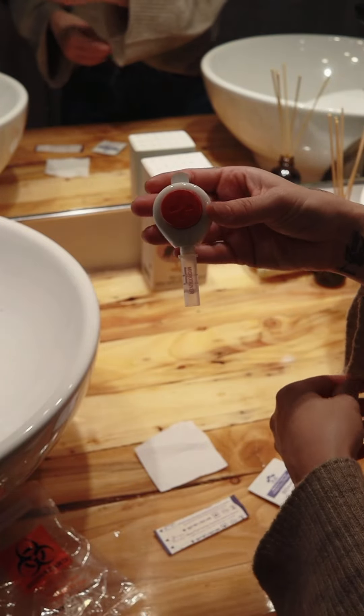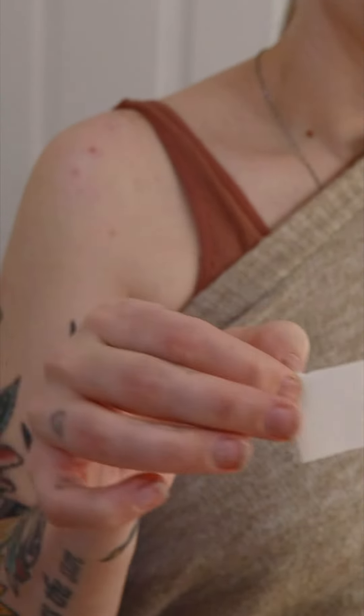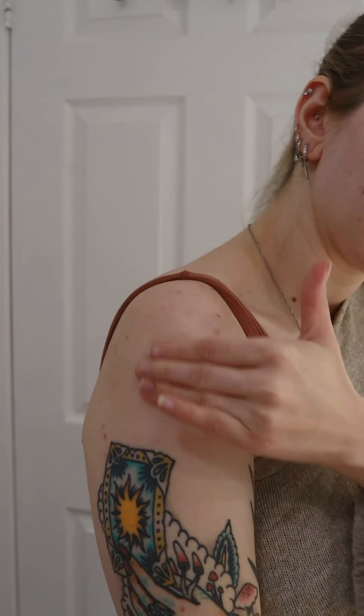Clean the sampling area located on the shoulder with an alcohol pad and then let it dry. Then, rub up and down with your hand for about two minutes to increase blood circulation.